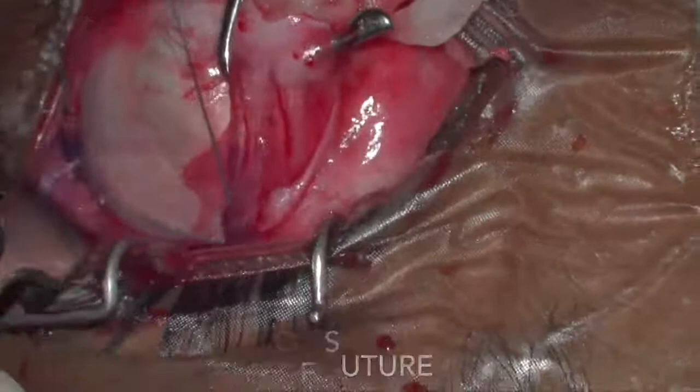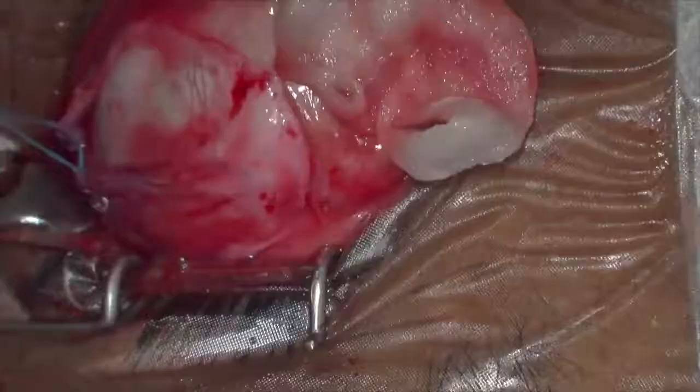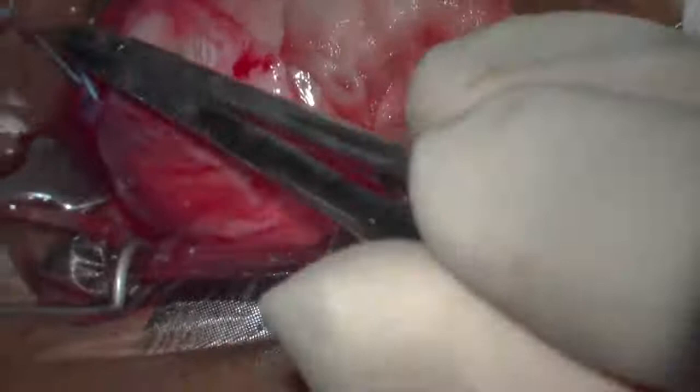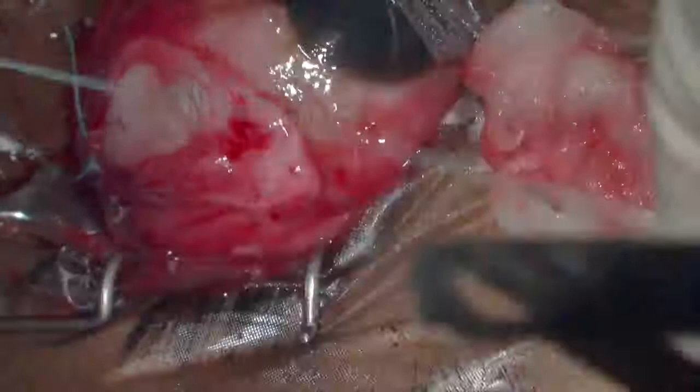Both ends of the superior rectus suture and the lateral rectus are pulled together to bring the bellies of the superior rectus and the lateral rectus together. The ends are then tied with a two-throw forward, single-throw backward, and single-throw forward knot.